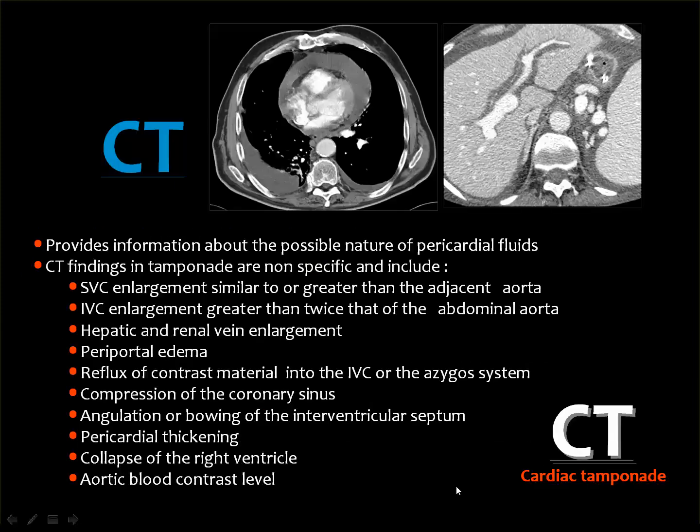Then these are easily appreciated findings on echocardiography. But also the CT scan may be of help, but you remember that echocardiography is a simple procedure. The machine can go to the patient in the ICU unit, and you have the Doppler facility, you have the ultrasound imaging, the usual ultrasound, which can show also pulmonary changes and pleural effusion as well.